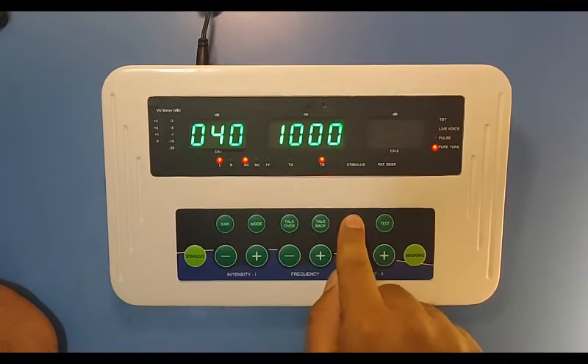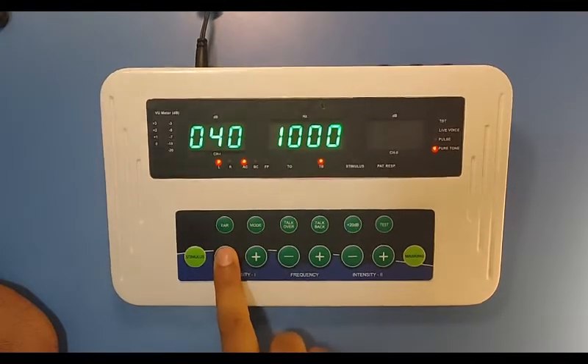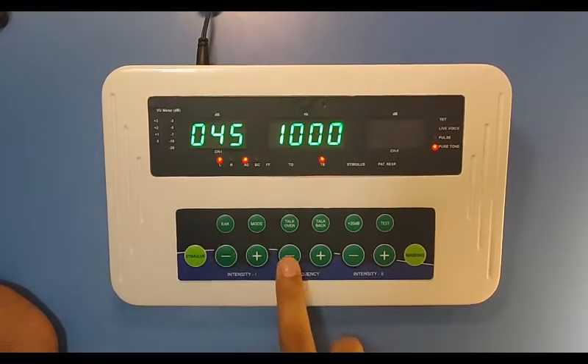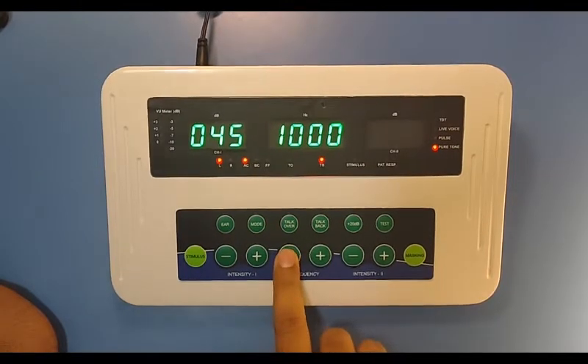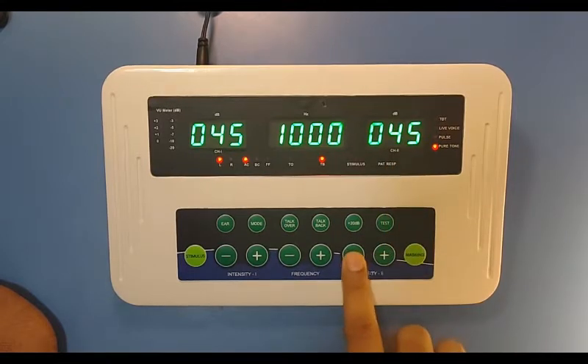You can see it is changing on the screen. This key is to provide the stimulus. This is to increase and decrease the intensity. This key is to increase and decrease the frequency, as you can see on the screen. This key is to increase and decrease the intensity of the masking. Masking will be turned on from here — you can see it is turned on. Now you can increase and decrease the masking intensity from here.